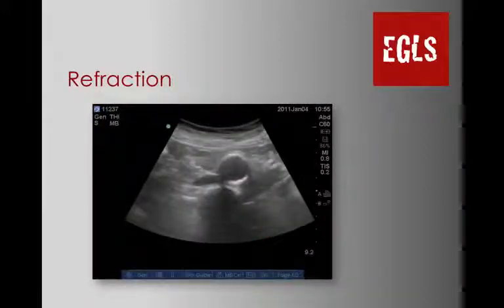Now let's take a couple of examples from the abdomen. Because there's less structure, it's easier to see the artifacts themselves. Here we have aorta and IVC. And these 2 black lines are refraction. Refraction occurs in these 2 areas because the beam that travels here travels in a linear fashion, whereas the beam that hits fluids will be deviated from its course. So no beam actually comes to this area and this one. They stay black on the screen. Now, do you see another artifact in this image? That's right, there's shadow behind the vertebral body.